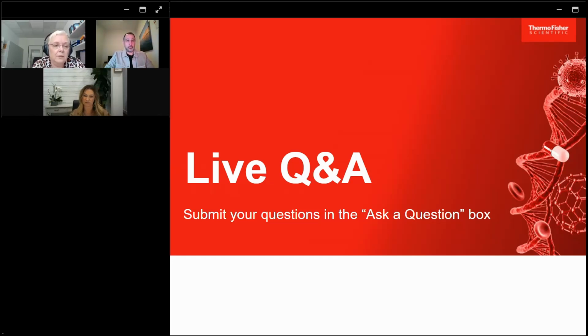So if this comes, and that's really a problem of our LIS, not the APAS system, then we will save, I think, half an hour more time again, when we have a direct connection to the LIS. And other laboratories have that, and they're quite happy with that, and with their LIS system it works.